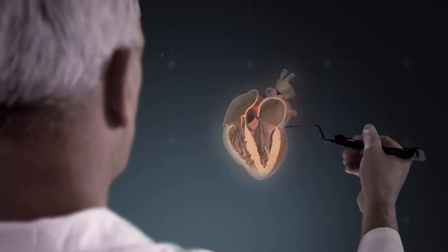For the first time in my career, I had the patient's virtual heart literally beating in the palm of my hand. I could freely crop the hologram to define a desired plane, giving me a comprehensive understanding of the spatial anatomy.